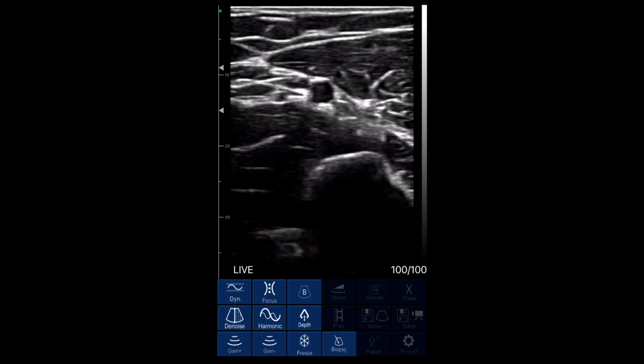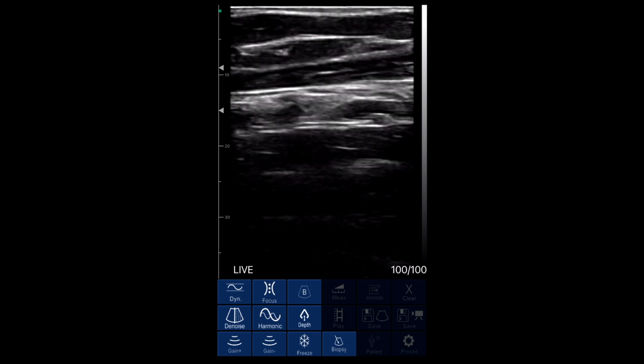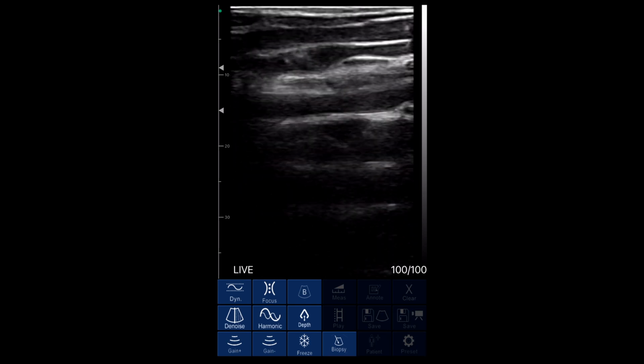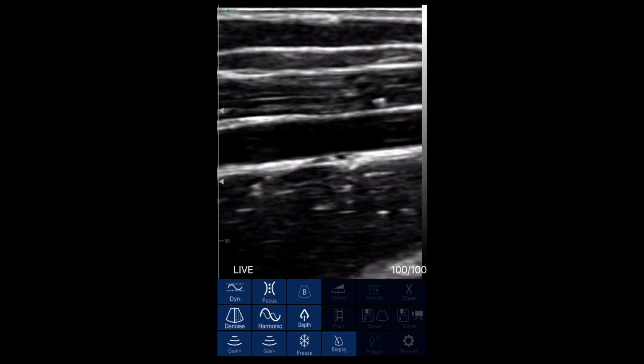That's going to be in my upper arm here. So I just want to show you what that looks like in transverse. And now I'm turning to show you what that looks like in long. I'm just compressing here so that we can tell if we're on a vein or an artery. You can see how good the quality is of this superficial imaging right here.